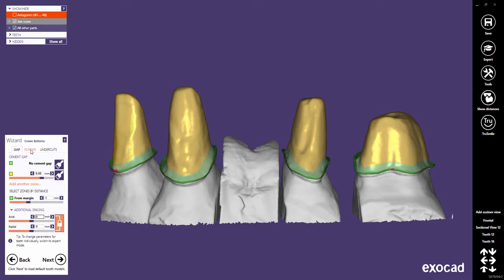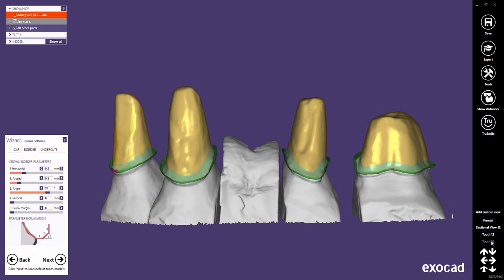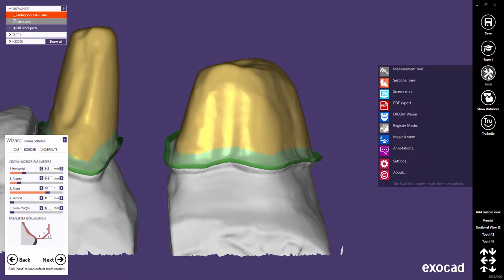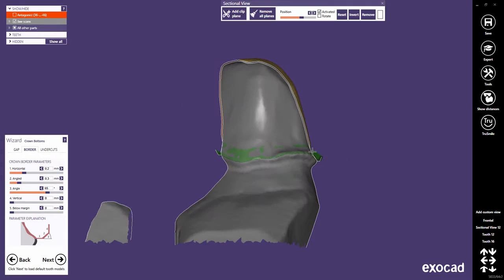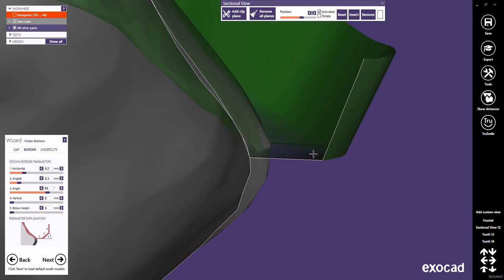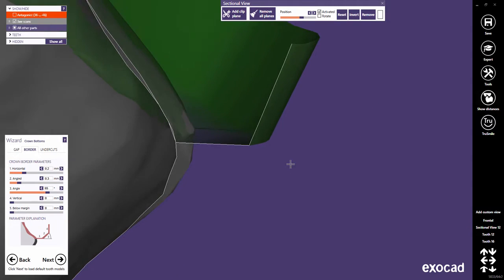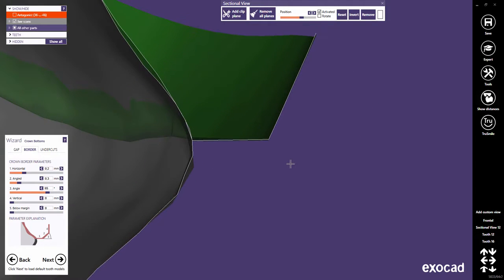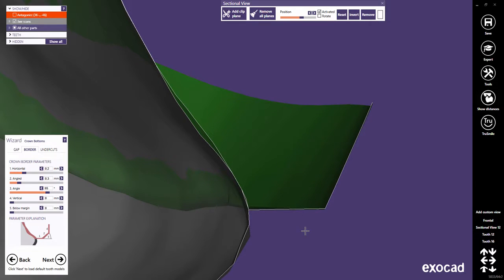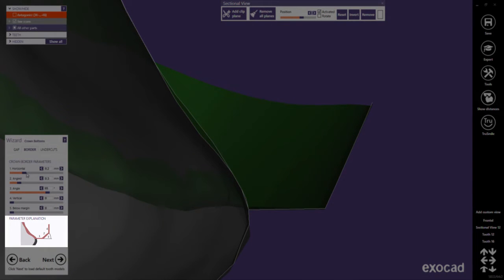Let's have a look at the border settings. I have prepared a sectional view which will help us to understand how the border shape can be influenced. The graphic illustrates the meaning of the sliders.